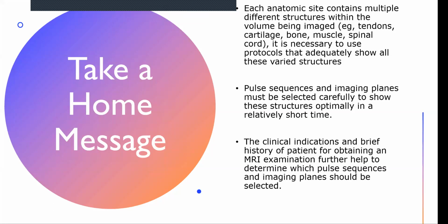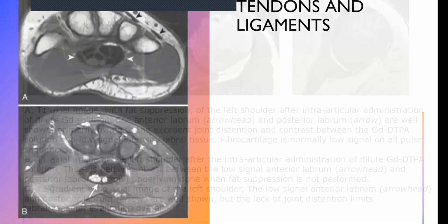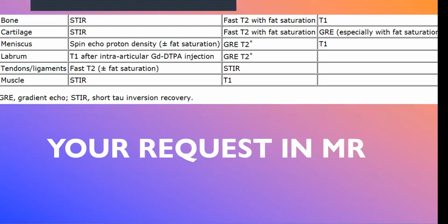Regarding the sequences and use of contrast, is this our job, or does the radiologist decide? No, this is a radiologist's job actually, but you have to request it. I put it here. This table summarizes it for you. When you have any pathology, you can request these sequences as you need them. Okay. Just to put it in your mind.